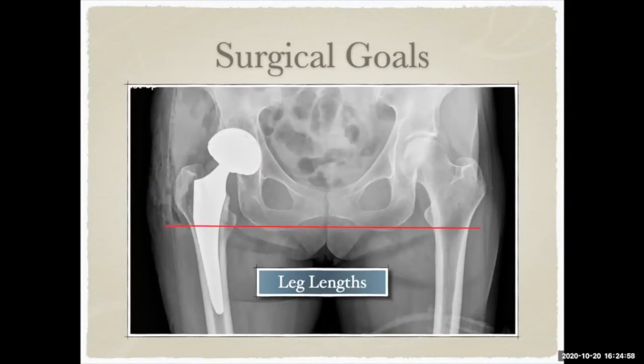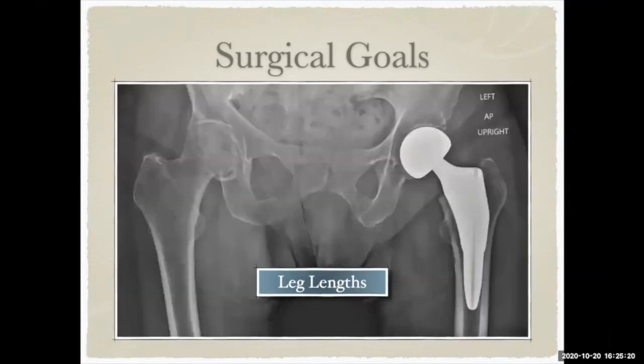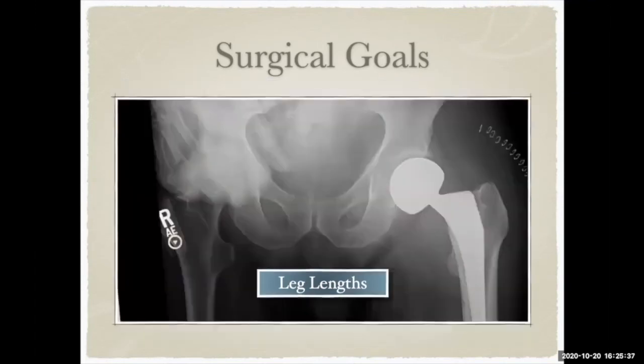So in this case, as you can see here, the left and the right hips are no longer equal. The line is transecting the left side right in the middle of the lesser trochanter. And on the right hip, which is on the left of your screen, the lesser trochanter is a little bit below, suggesting that the right leg is a little bit longer. All right, here's another example. So a line drawn through the center of the pelvis. You could see that on the right hip, it is going right through the center of the lesser trochanter. And on the left hip, the replaced hip, the lesser trochanter is slightly below, therefore the left leg is a little longer.